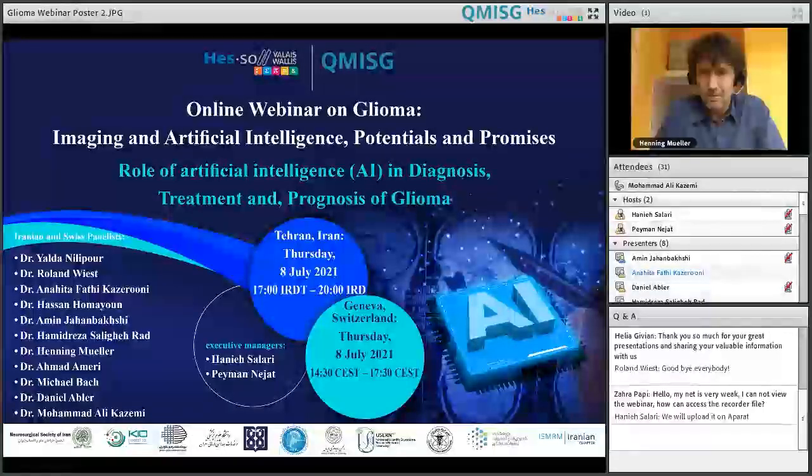They say intraoperative neuronavigation can solve this problem to some extent, but if we have imaging 2 or 3 days after surgery, we can have routine FLAIR imaging as T2 images, and as we all know, and many researchers have shown, in nearly all cases FLAIR images show a much more extensive abnormal area than the actual tumoral tissue.